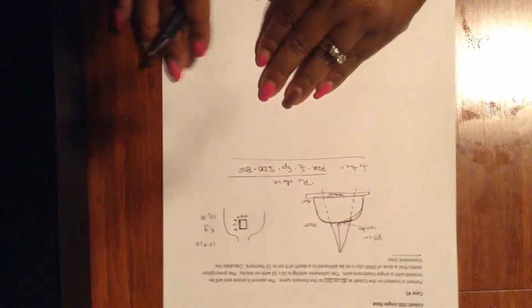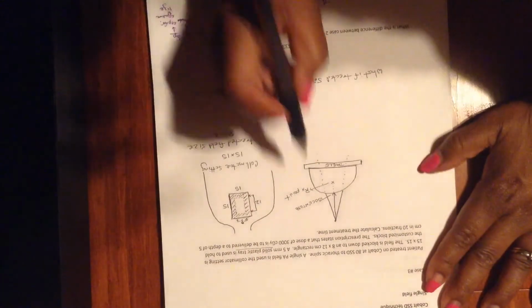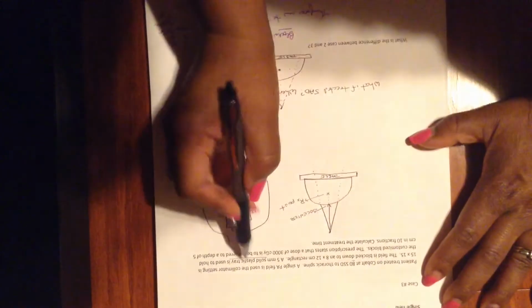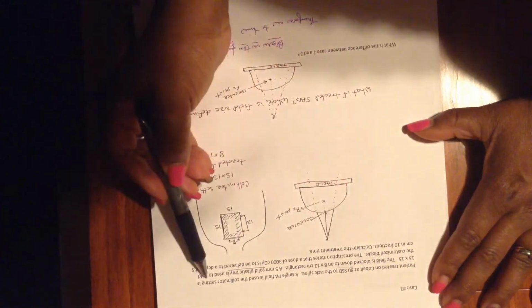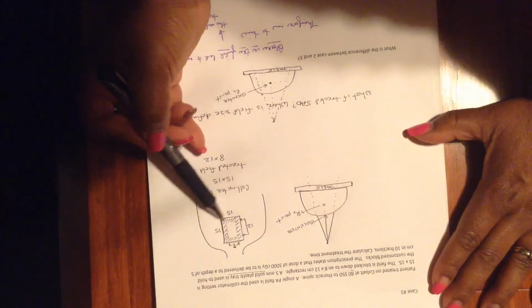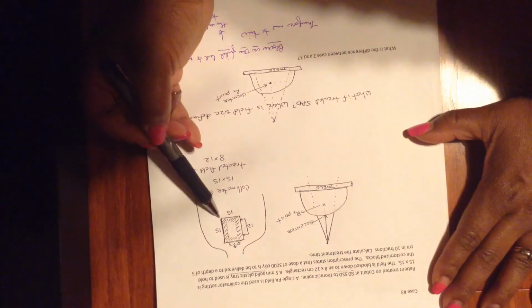Okay, now let's take a look at case number 3, which is just a little bit different. Same machine, same technique, single PA. This time, we're using blocks. We have the collimator set at 15 by 15. This is the collimator opening. X would be 15, Y is 15.